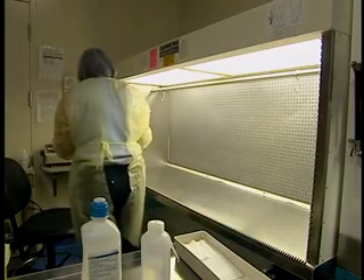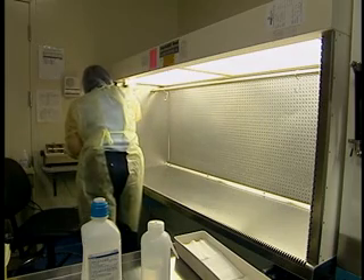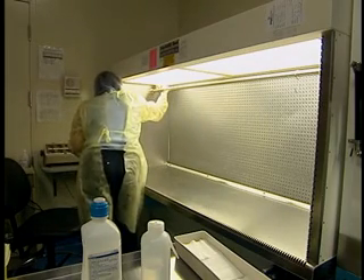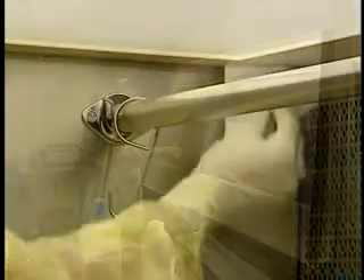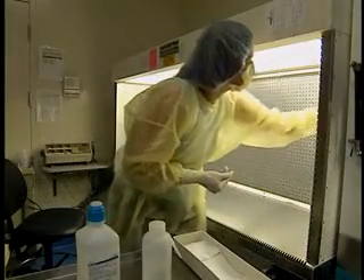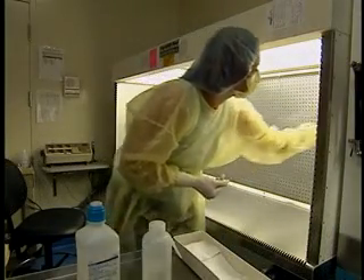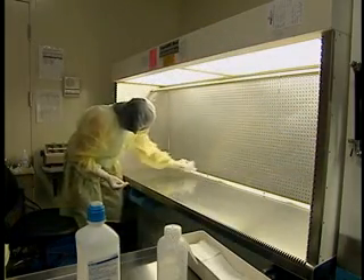Then proceed with the daily cleaning and disinfection working in the following order: first, the sealing of the hood; then the first side starting at the top; next, the horizontal bar and hooks; then the second side; and finally, the work area.